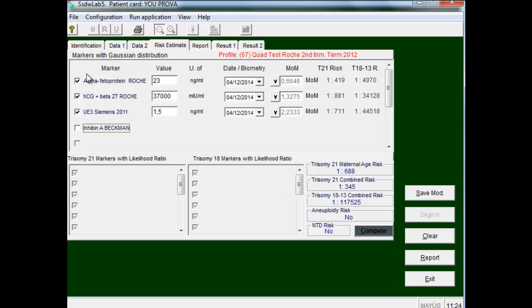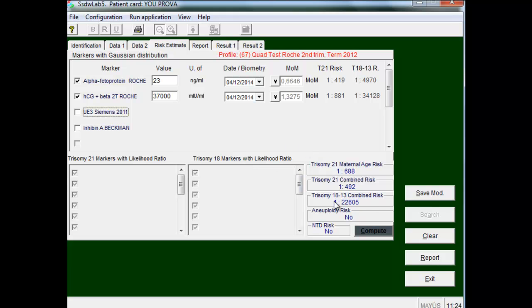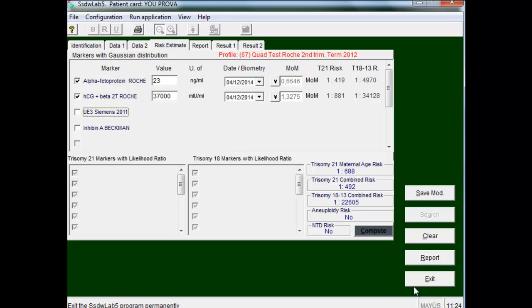And if we want to realize a double test we cancel the value of unconjugated estriol. It only will take into account the alpha-fetoprotein and chorionic gonadotropin values, whereby the risk is for a double test. And so this simple way we performed a quadruple test.